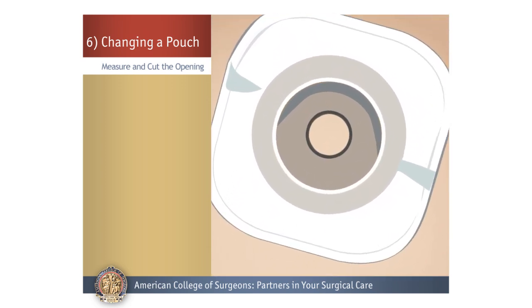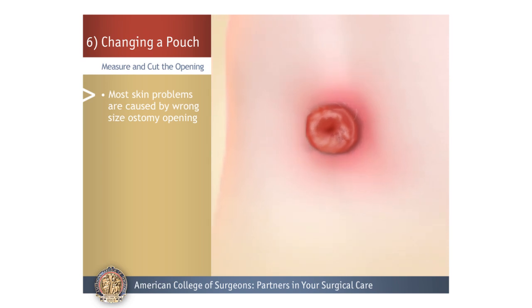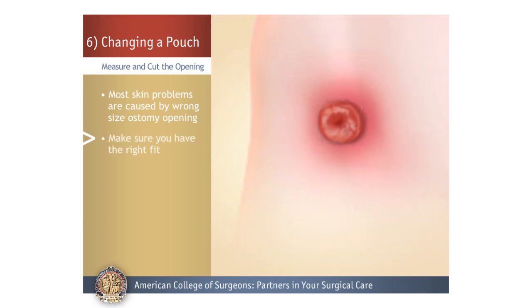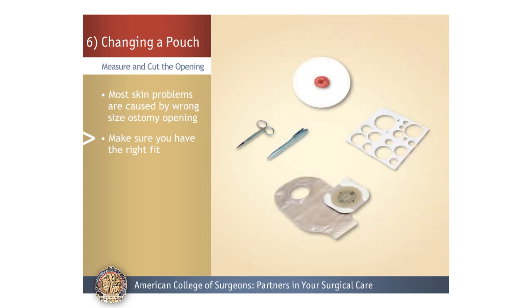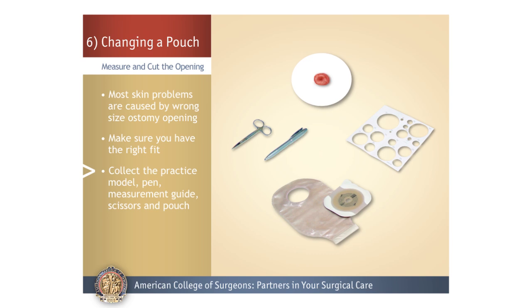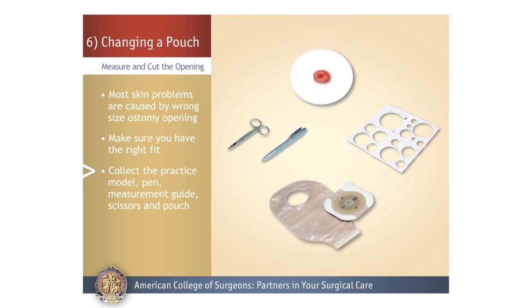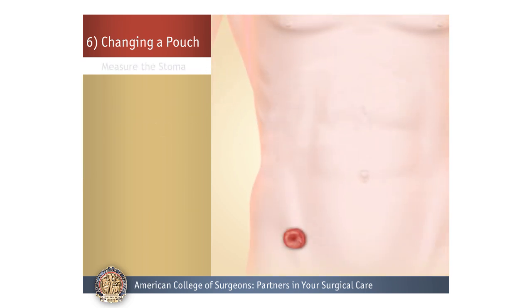Measure and Cut the Opening: Next, measure and cut an opening in the fresh barrier. Most skin problems are caused by the ostomy opening not being cut to the right size, so it is important to measure the stoma and make sure you have the right fit. You will need the stoma practice model, pen, measurement guide, scissors, and pouch from your skills kit.